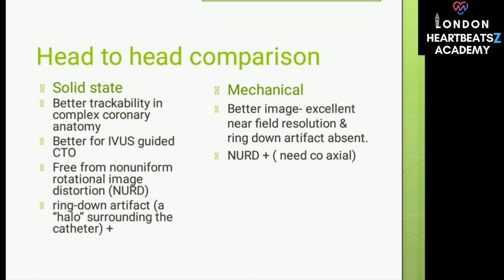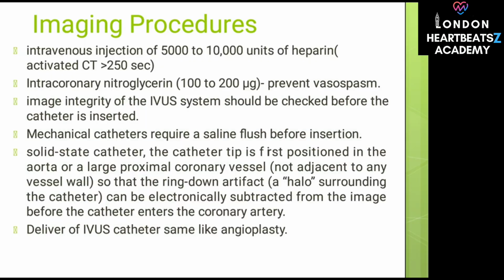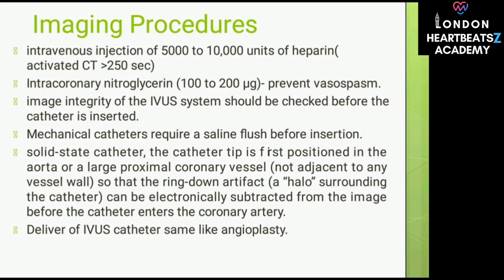That's a good summary. Now, let's walk through how an actual IVUS procedure is typically performed. It sounds like there are several key steps that cardiologists follow. There are indeed. The first crucial step is usually to administer intravenous heparin to the patient. Heparin is a medication that helps to prevent blood clots from forming during the procedure. Anticoagulation. Exactly, which is obviously very important when we're working inside blood vessels. The target activated clotting time, or ACT, is typically kept above 250 seconds to ensure adequate anticoagulation.